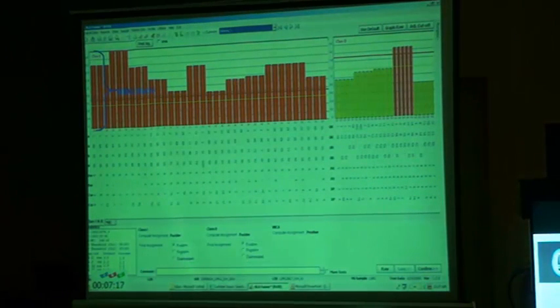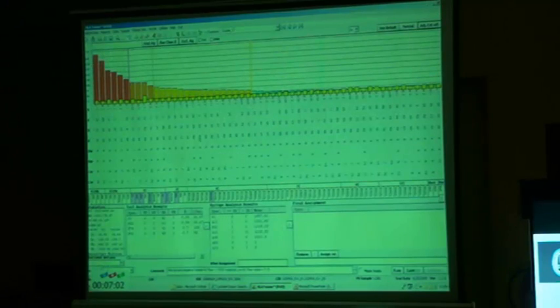This is how the result looks if it is a screening test. The screening test is for HLA class 1, HLA class 2, and MICA as well. And this is for a single antigen.